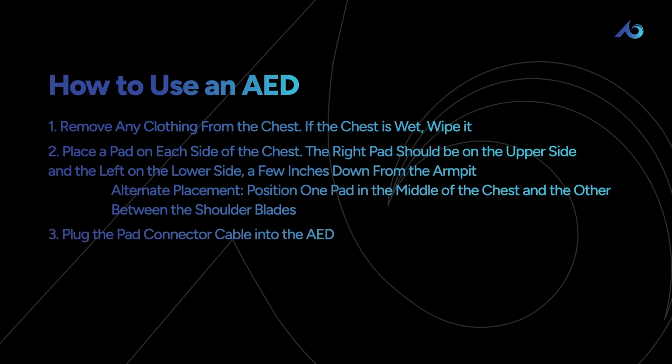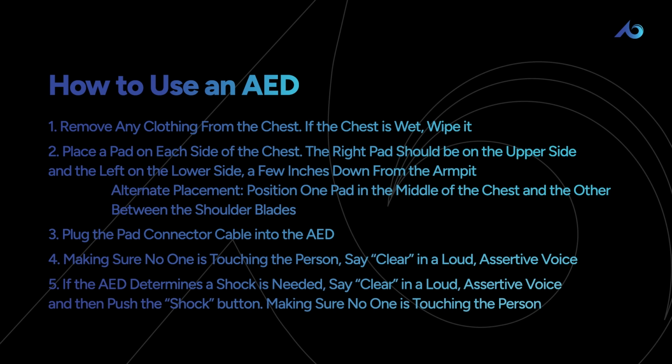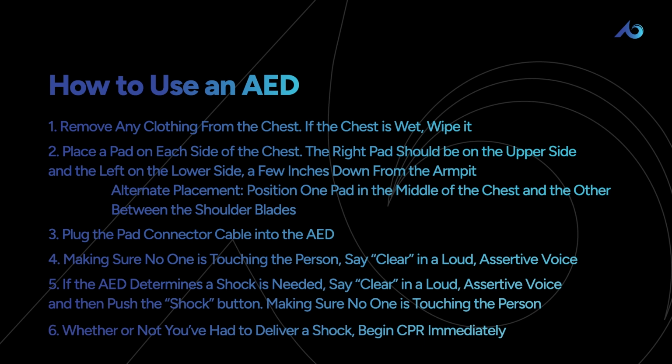Plug the pad connector cable into the AED if it isn't already connected. Making sure no one's touching the person, say "clear" in a loud, assertive voice. This will enable the AED to analyze the heart rhythm. If the AED determines a shock is needed, you'll do so by saying "clear" in a loud, assertive voice and then pushing the shock button. Again, make sure no one is touching the person. Whether or not you've had to deliver a shock, begin CPR immediately.